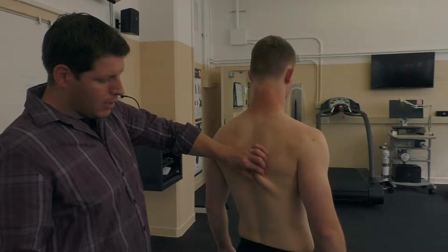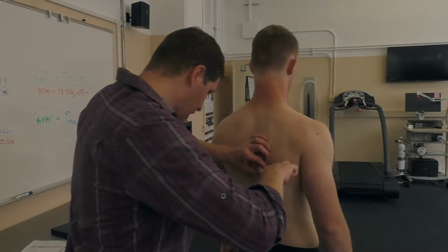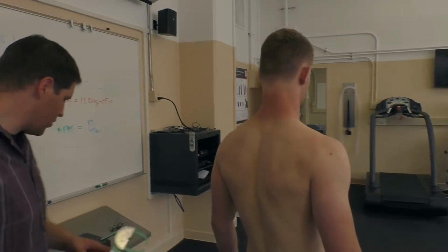Reach down to the muscle, make sure the muscle's not in the pinch. You come in, you place the calipers, you take your reading, and we're done with that.